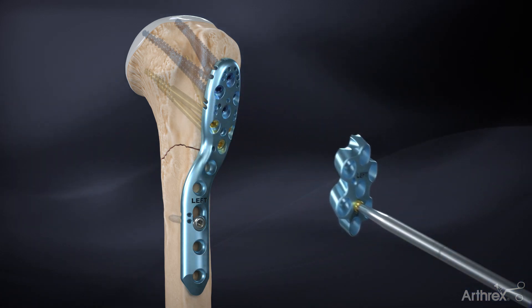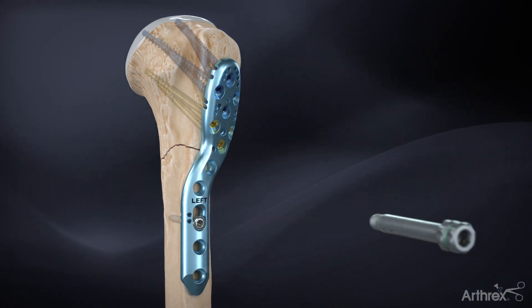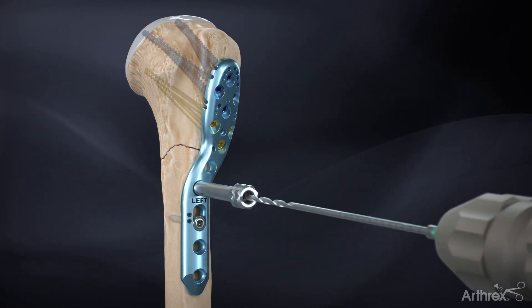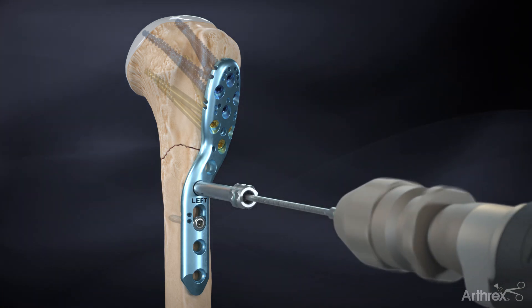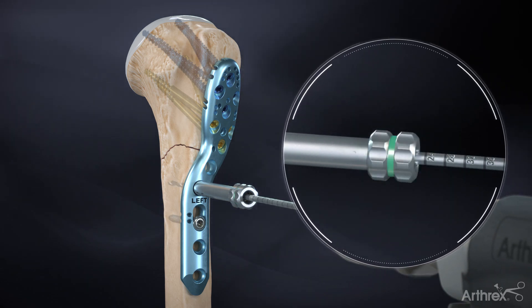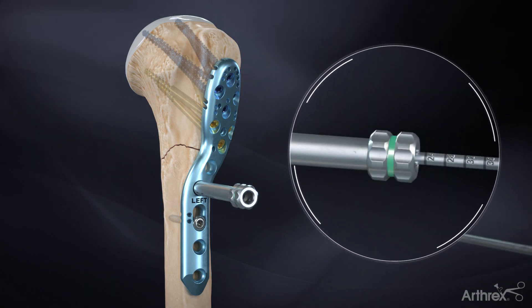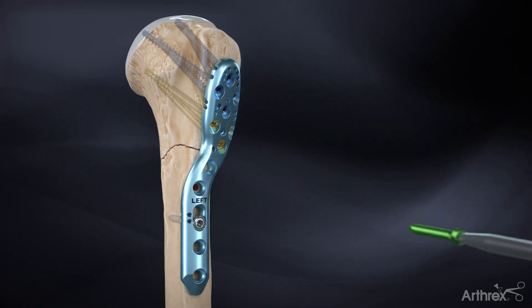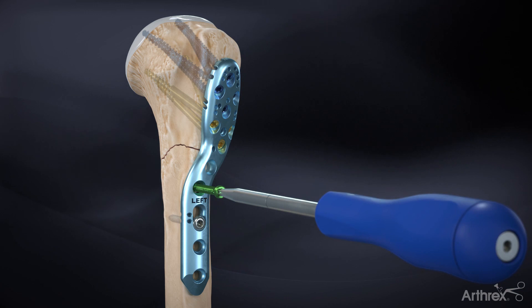For the distal holes, begin by threading the 2.5 millimeter locking drill tower into the screw hole. Drill bicortically using the 2.5 millimeter drill and use the calibration lines in the drill bit to determine screw depth. Unthread and remove the locking drill tower and insert a 3.5 millimeter locking screw using the hex driver.